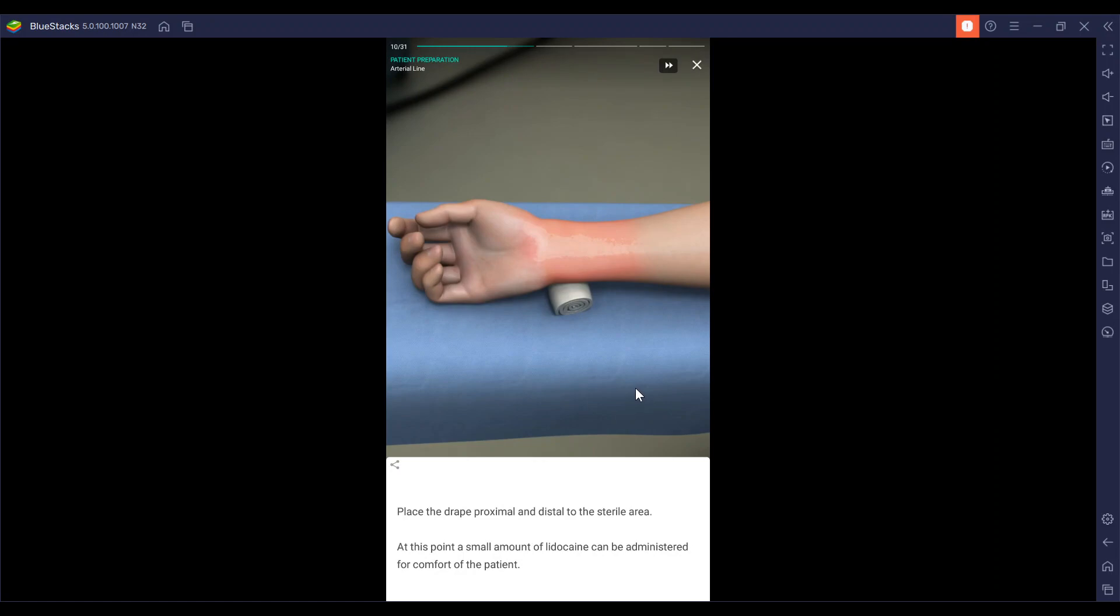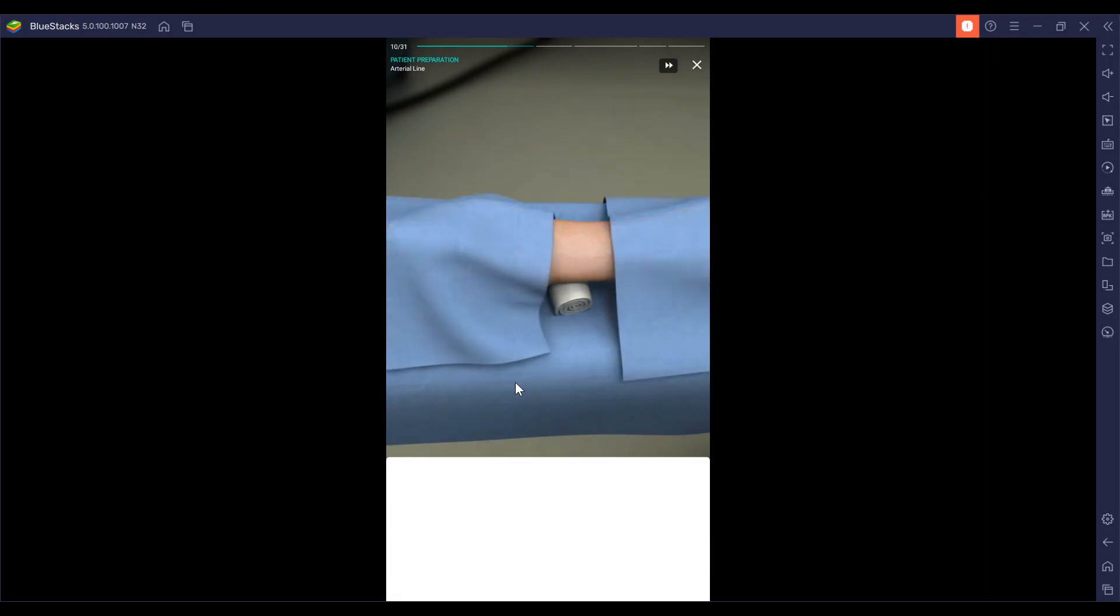We're going to remove that and place the drape proximal and distal to the sterile area. And if needed, a small amount of lidocaine can be administered for the comfort of the patient.